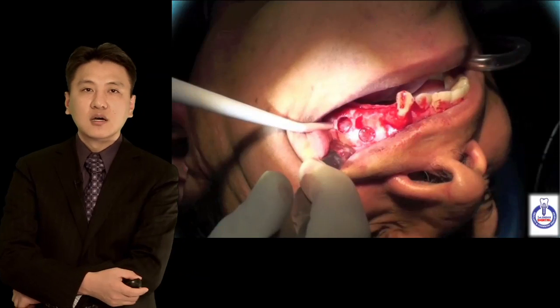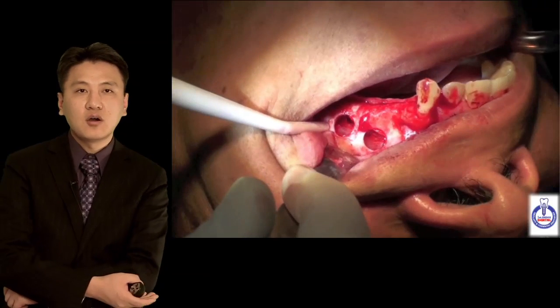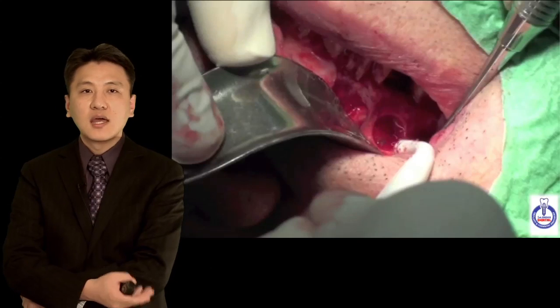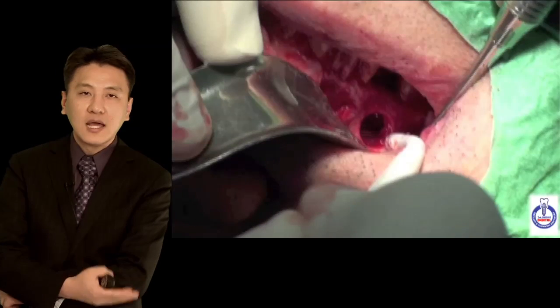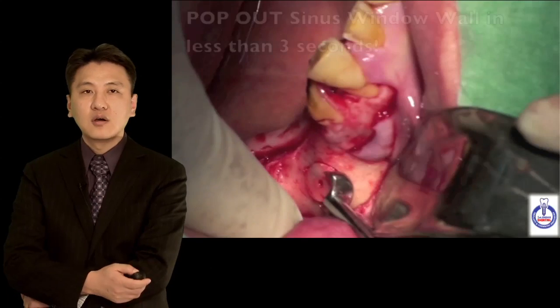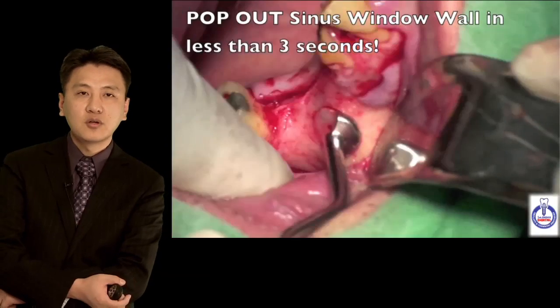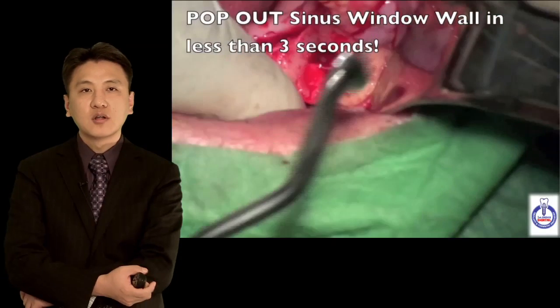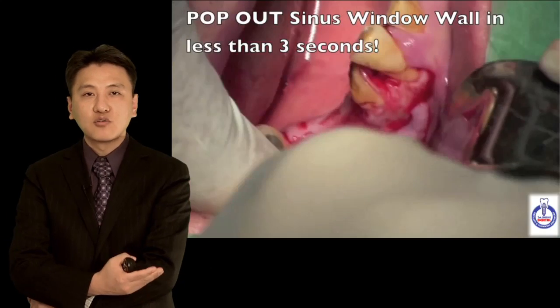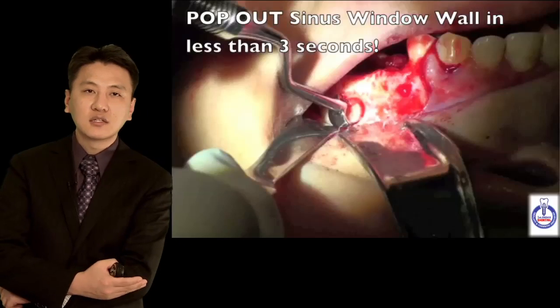In this module, I will discuss a technique invented by myself called the cluster window technique, as well as a lateral window technique that can be opened in less than three seconds. A specialized instrument called the window opener — which looks like a bottle opener — can be utilized to open the sinus wall in less than three seconds.